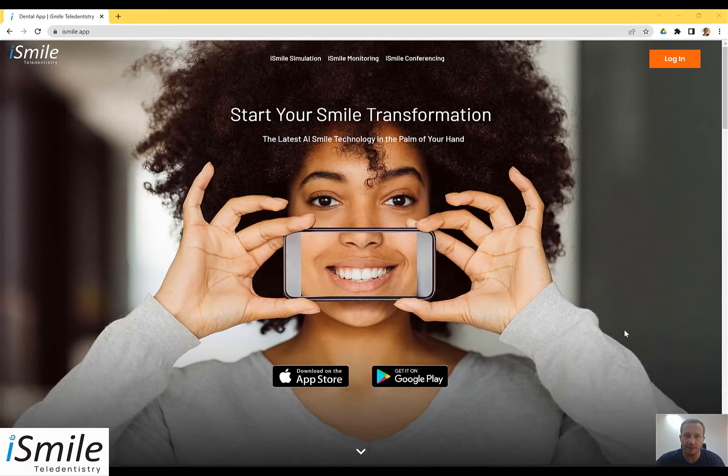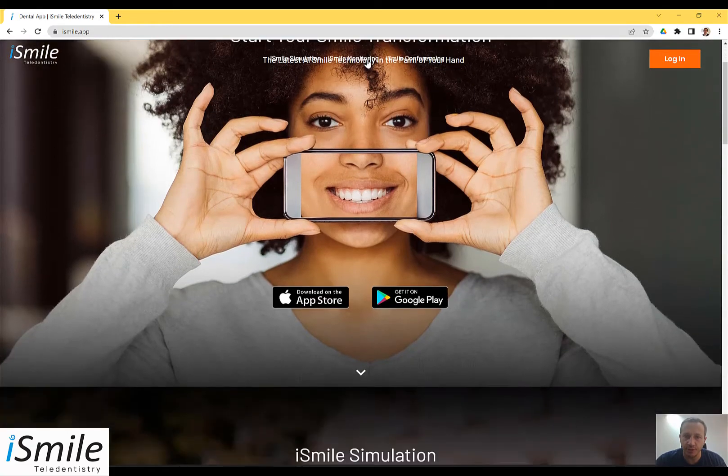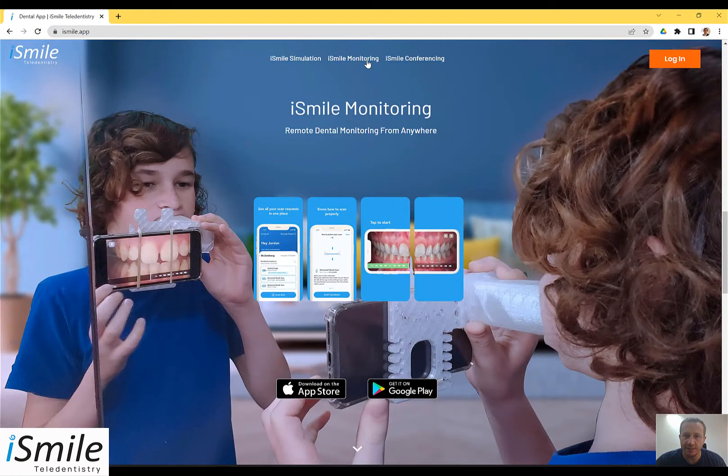Hello and welcome to iSmile Tel Dentistry. iSmile Tel Dentistry is a new dental technology app that brings the latest AI Smile technology directly to your cell phone, directly to the palm of your hand. My name is Michael from iSmile and in this video I'm going to be showing you how to use iSmile monitoring to use your cell phone to scan and take photos of your teeth.